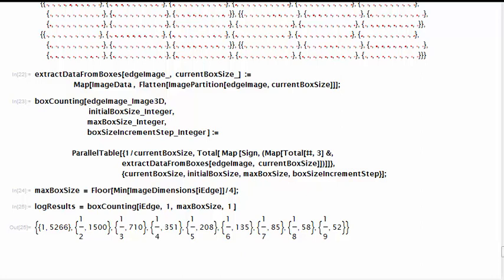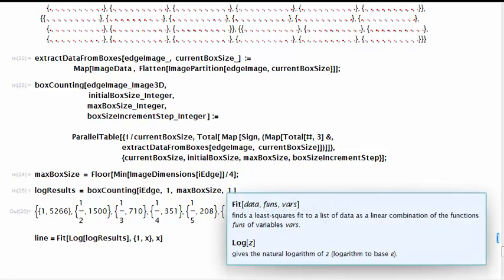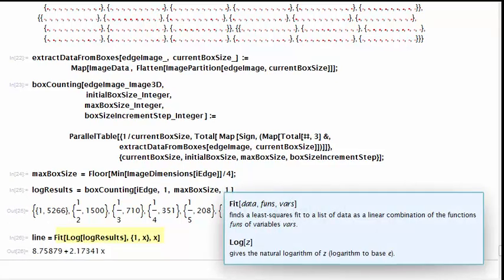In order to estimate the fractal dimension, we need to perform a linear regression on the log log plot of these pairs of values. We call the logarithm function on log results and then call fit to perform a linear regression on the points.